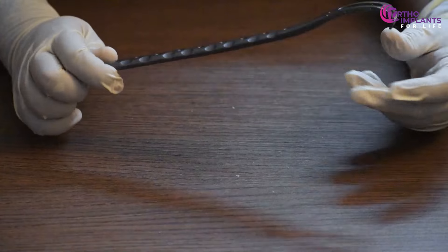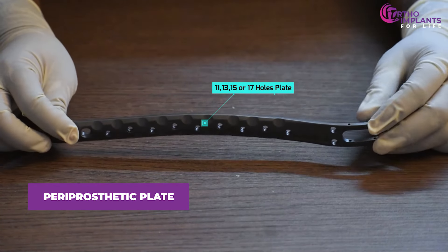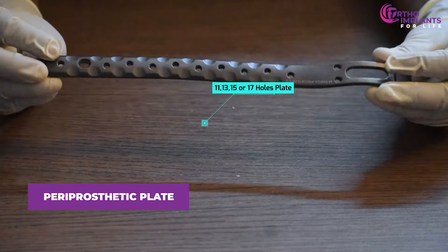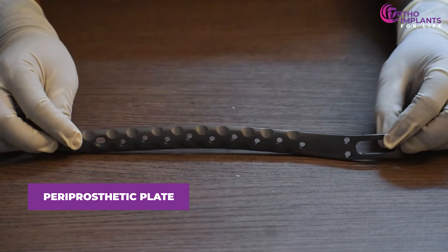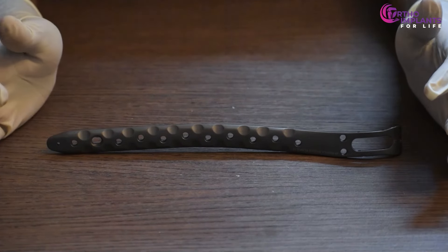First, the doctor will choose the plate size — whether to take an 11, 13, 15, or 17-hole plate — and will also choose the side depending on the fractured leg, whether it is left or right.